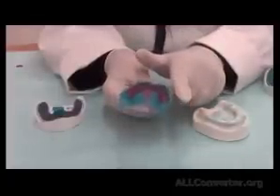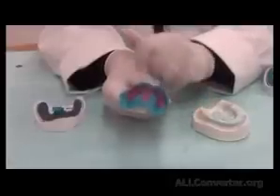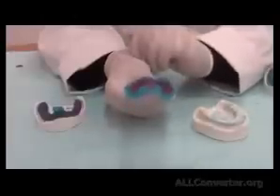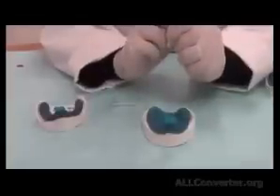So inside the patient's mouth, I begin checking that all of my borders are short of the sulcus. If any border is touching the sulcus inside the patient's mouth, I bring my bur and reduce it to make sure that the border is all continuous inside the patient's mouth. Once checked in the patient's mouth, now I'm ready to do border molding.